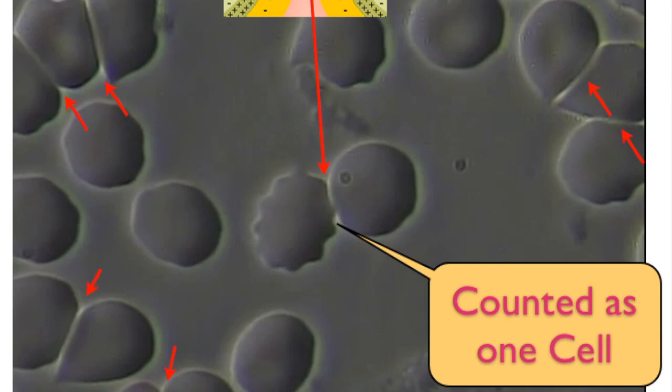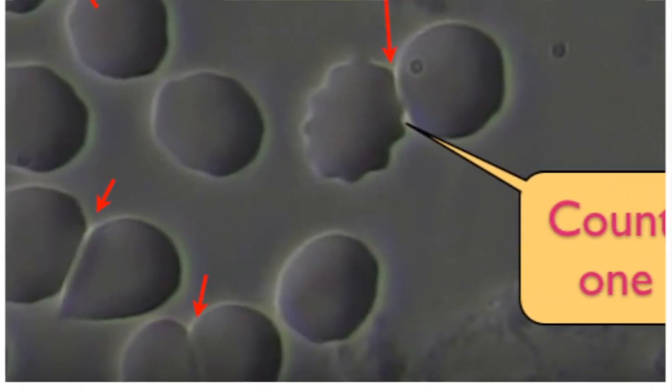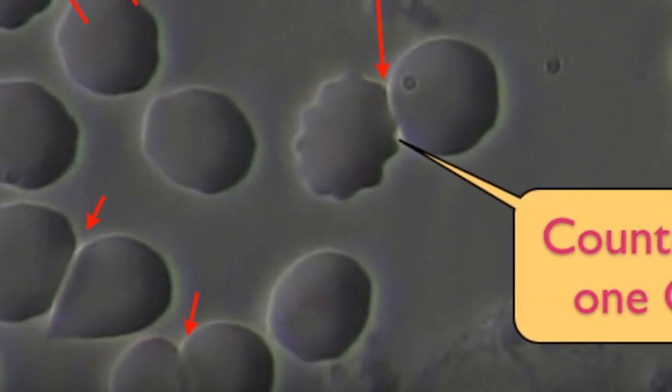Circulating cells, including red blood cells, white blood cells, and platelets, are counted and sized electronically by these modern instruments. One such instrument, the Coulter counter, generates an electric pulse when a blood cell passes through a small aperture surrounded by electrodes. Each electronic pulse represents an individual cell, and the pulse height indicates the cell volume.